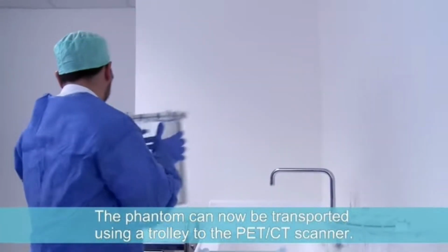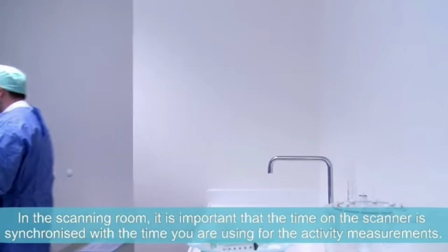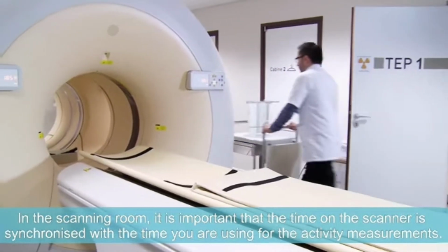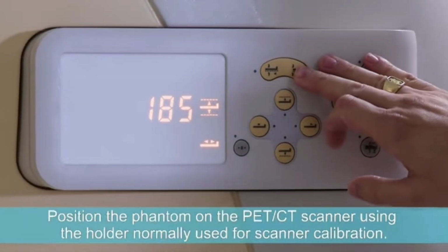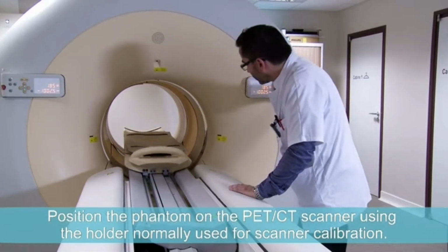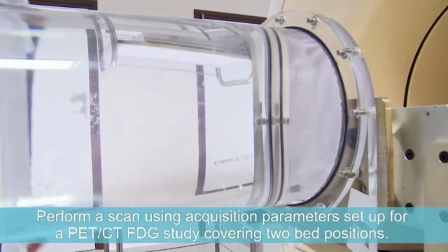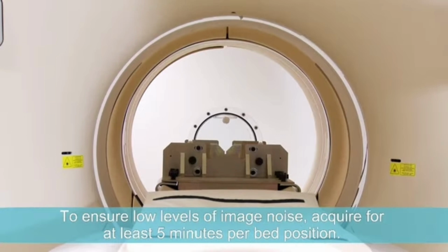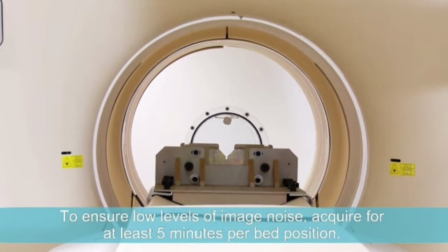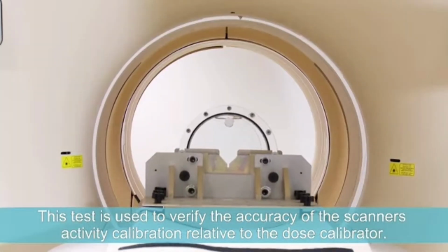The phantom can now be transported using a trolley to the PET-CT scanner. In the scanning room, it is important that the time on the scanner is synchronized with the time you are using for the activity measurements. Position the phantom on the PET-CT scanner using the holder normally used for scanner calibration. Perform a scan using acquisition parameters set up for a PET-CT FDG study covering 2 bed positions. To ensure low levels of image noise, acquire for at least 5 minutes per bed position. This test is used to verify the accuracy of the scanner's activity calibration relative to the dose calibrator.